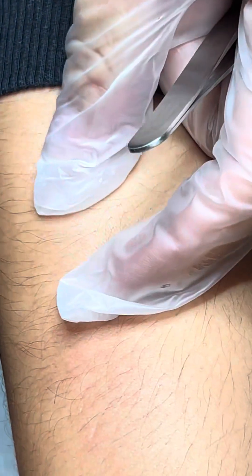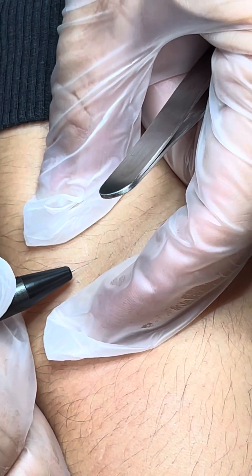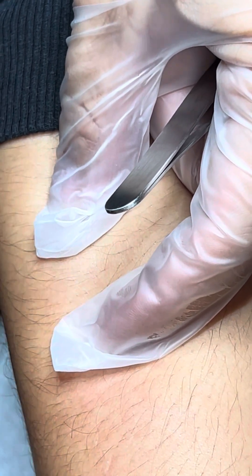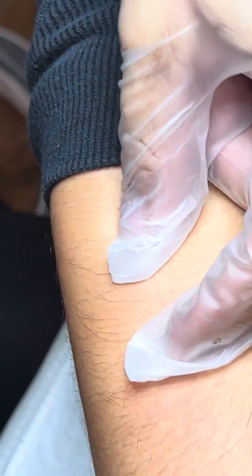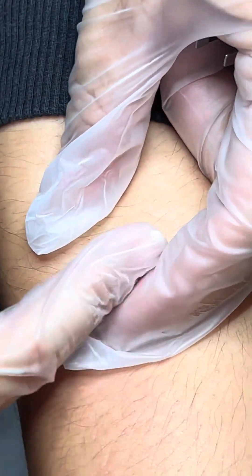That looks like a good one, honey. Is it because I'm not grabbing it in the same spot? Okay, let me teach you something — go back. Do you know where that hair is? The lights — yes, that's fine. Hang on. Grab your tweezers, and that same hair — I want you to slightly pull it, but don't pull it all the way out.